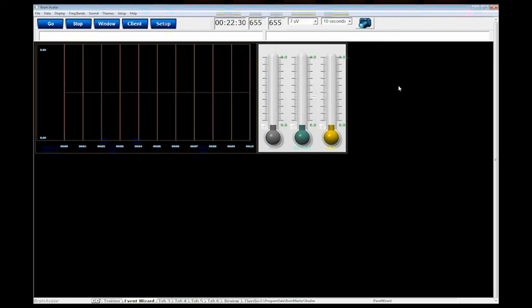Yeah, there's actually two different devices you can use. One is for a lot less money. There's a projector that just came out that patients can actually hold in their hand and put on the ceiling. That's about $200 or $300. The Sony is a lot more money, but it's a much better device. I understand that one. I've never really had a problem with Sony. So there's really two options that are both much better, I think, than a second monitor in terms of the patient feeling part of the process.